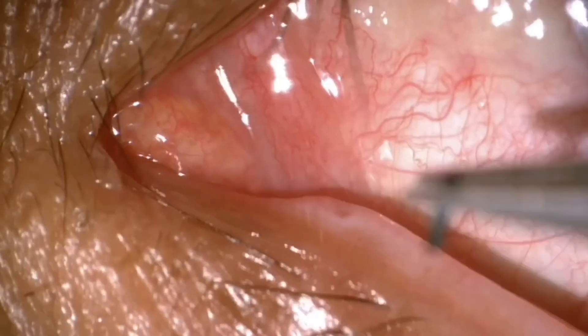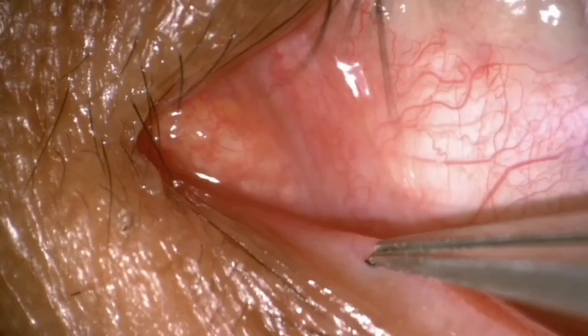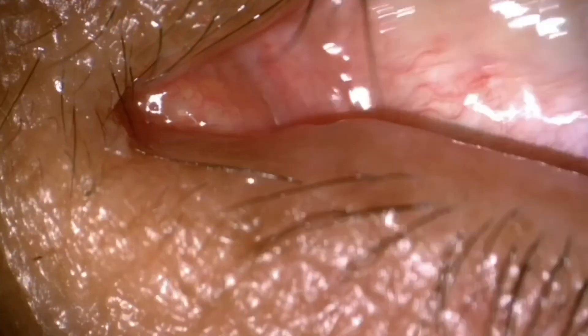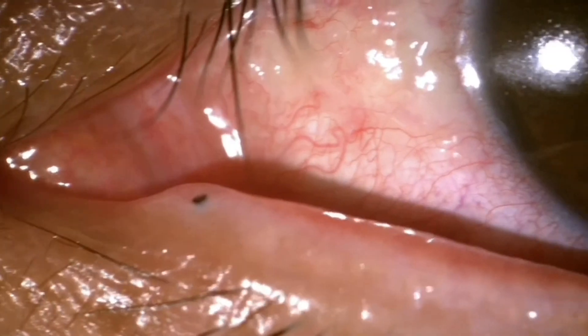In this video I can be seen inserting a collagen temporary punctal plug into the patient's lower tear duct. This patient does not feel anything as this procedure is painless. Here you can just see the top of the punctal plug in the tear duct.